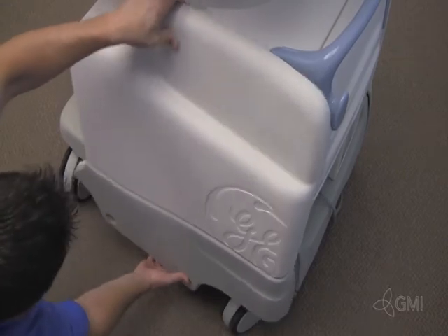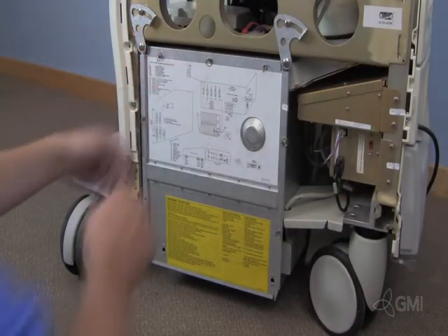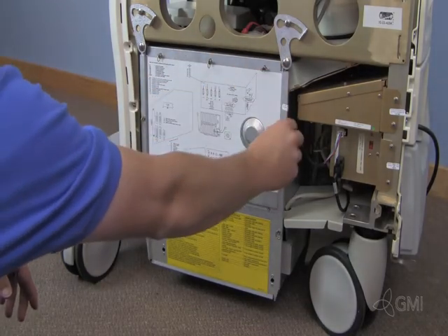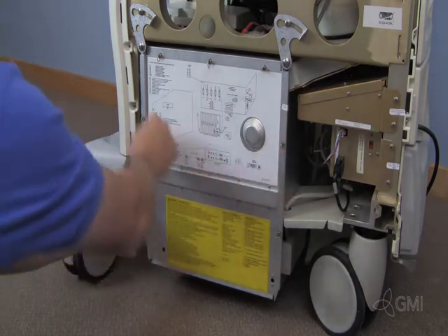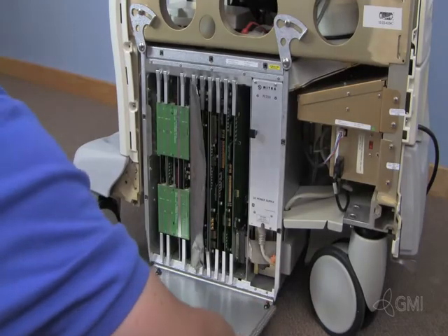Remove the right side cosmetic panel by pulling from the bottom and lifting up. Remove the screws from the card cage cover. Tilt down and remove the card cage cover.